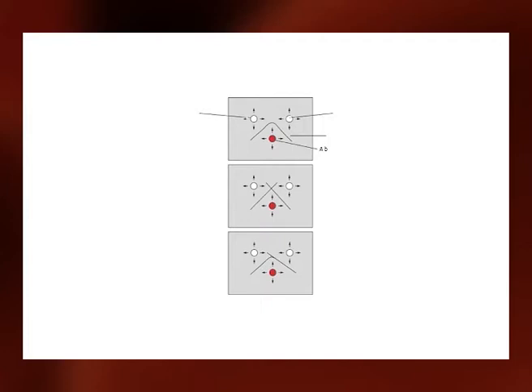If the 2 antigens are related, that is, they share a common epitope but are not identical, then the lines will merge with a spur formation. The spurs are continuations of the line formed by that antigen due to its unique epitope. This phenomenon is known as partial identity.